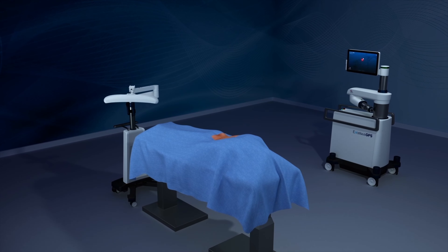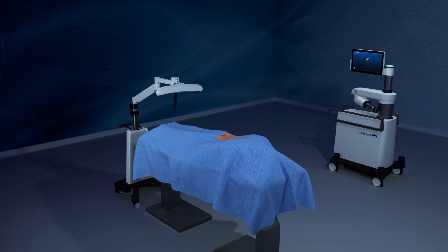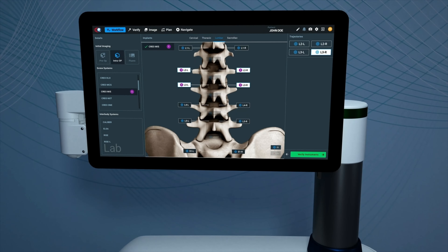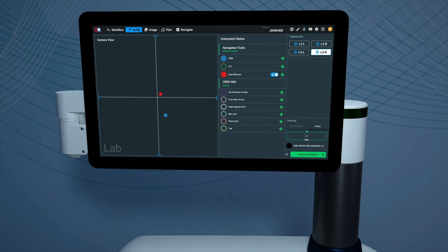At the beginning of the case, the camera is undocked from the robotic base station and placed at the foot of the bed. Next, the case is set up on the robot's touch screen, where the levels of interest, implants, and imaging workflow are selected.